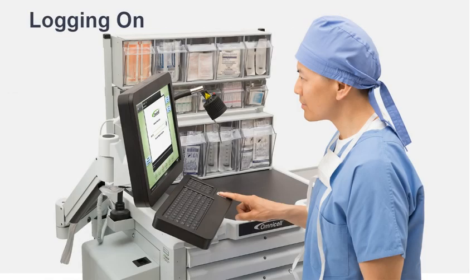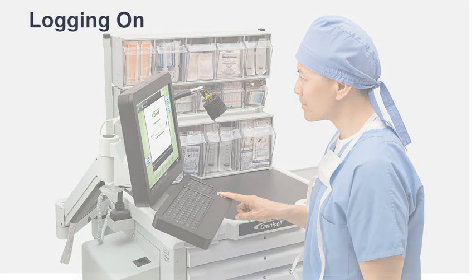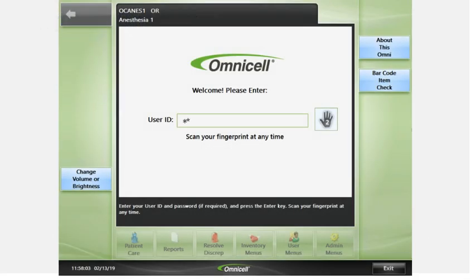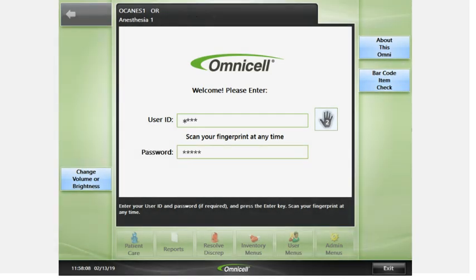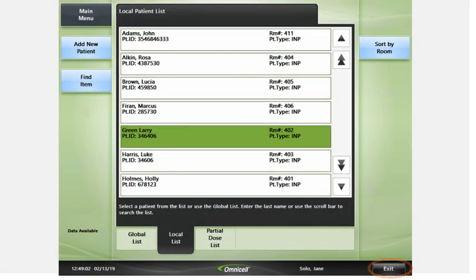Log on to the anesthesia workstation by using your fingerprint or by entering your username and password. Press Exit to log off the cabinet when you are done. This ensures that no transactions can be completed by another user with your ID.